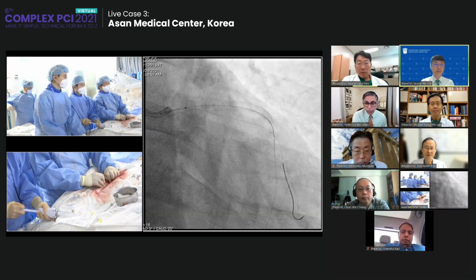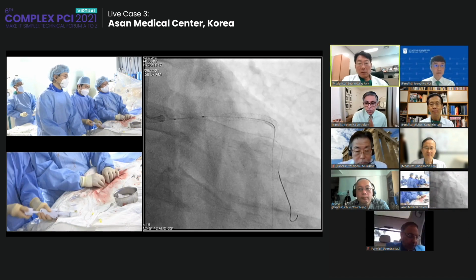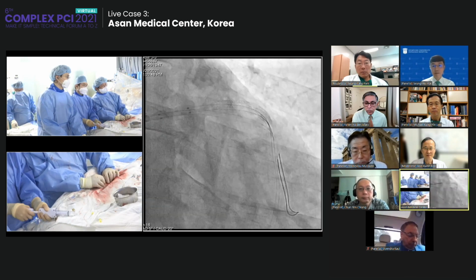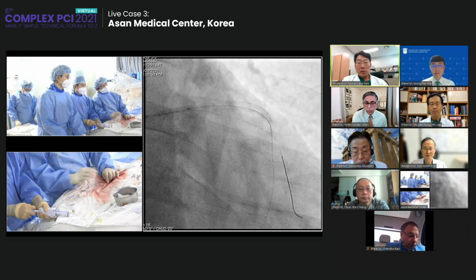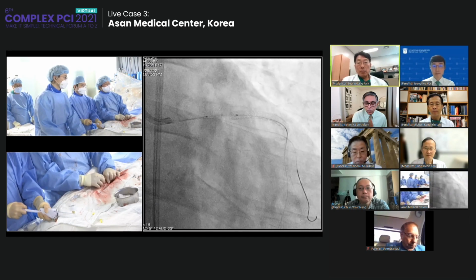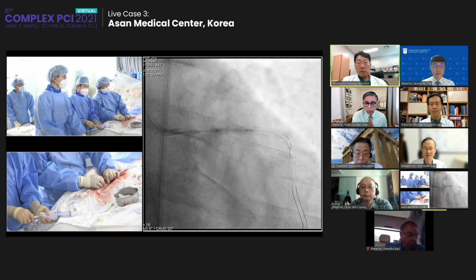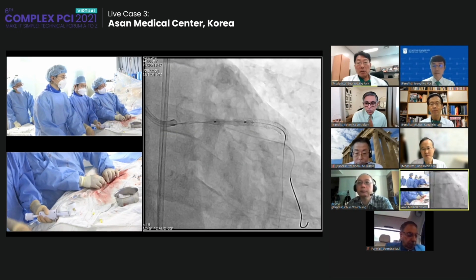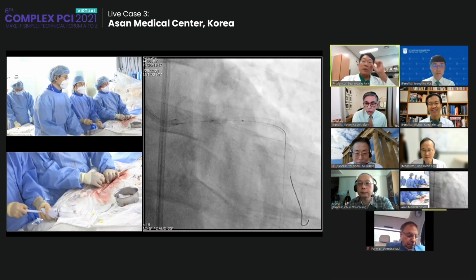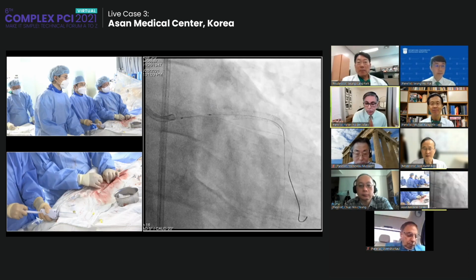All right. This is a 2.5 by 28. You have to dilate a little bit further distal, just a push-up. Deflation. About the stent area, right? More push in. All right, great. Deflation. Is there still some indentation over there? Yes. I need a bigger balloon.